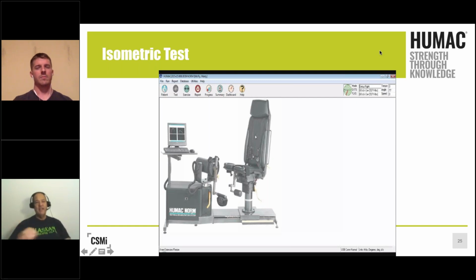You can go back to 1986, Bill Stauber, Greg Bennett, Medicine, Science, Sports, and Exercise was the very first time anyone talked about isokinetic exercise really looking at an eccentric deficit. And we see it all the time now that we're testing that way. But they really looked at, you could actually have an eccentric deficit when you don't have a concentric deficit.